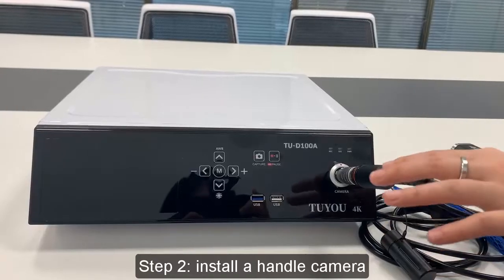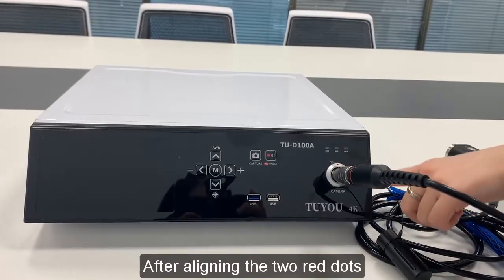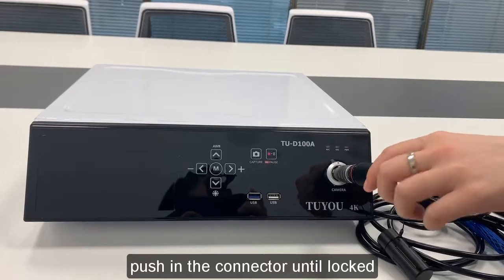Step 2: Install the handle camera. After aligning the two red dots, push in the connector until locked.